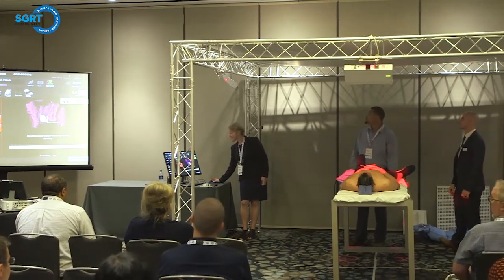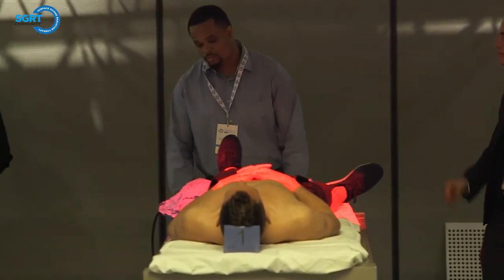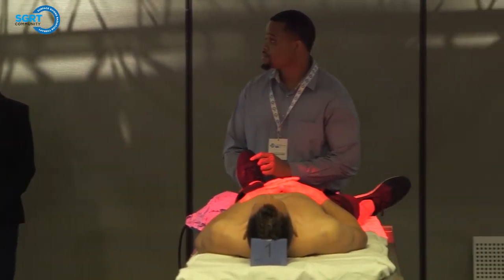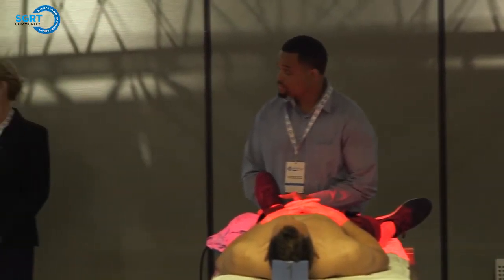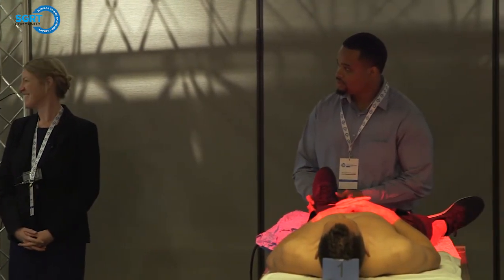Okay, so you can start with whatever you want. We'll go ahead and press monitoring so we can see what's going on. I didn't really mess them up that much, so, okay. Okay, so go ahead and start the timer now. Okay. All right, if we want some cheerleaders, some motivation here, get that going. I know. It was very enthusiastic.